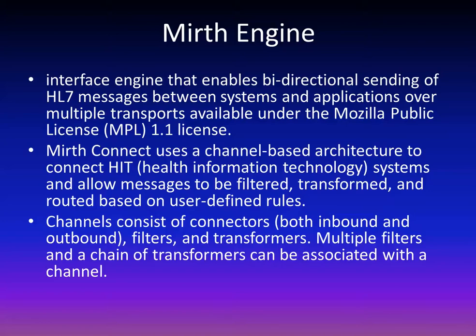If we want to get the report that we generated back into their medical records, we have to send it into their EMR. To do that, we have to have an interface with their EMR. One way we can do that is to perform the interface with Radius for each of our individual customers. It's possible to do that, but it's going to cost about $5,000 for each interface, and it's going to take time and manpower, as well as communication with Radius to get it done.